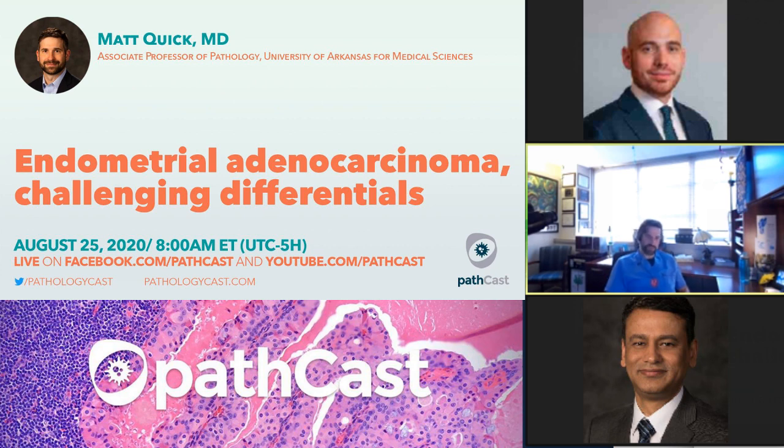Serous can have mismatch repair deficiencies, but it's not common at all. And so I think that using mismatch repair deficiency could be helpful. Certainly, PAX2 loss has been something that's been associated with endometrioid carcinomas, not so much with serous carcinomas. So there are a few stains out there that I like better than P16, just because, like you said, you get overlap in these stains.